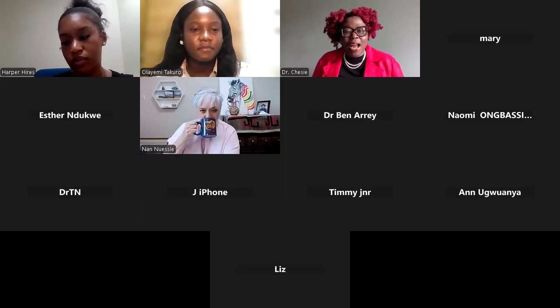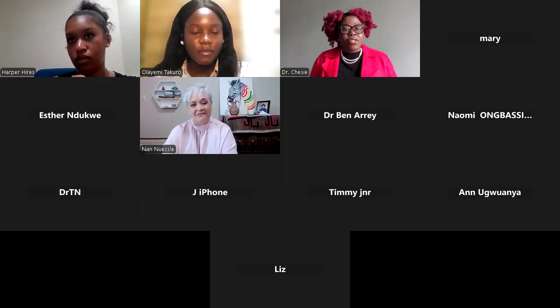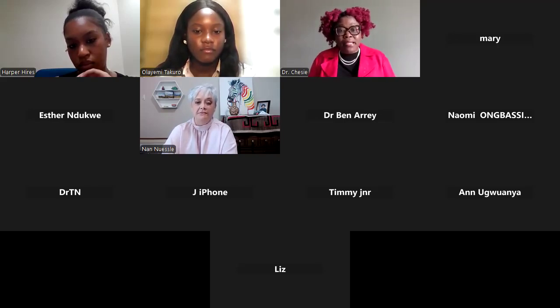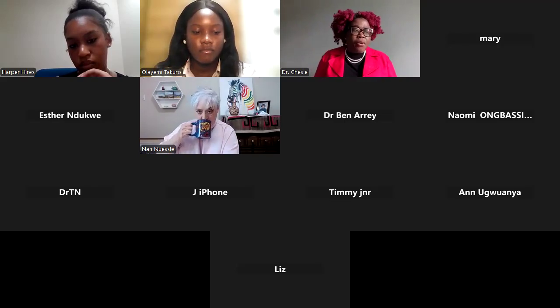Yeah, everything she said are actually the things that happen with some of the errors. And this series of errors that she made mention of in the lab, we call them exogenous errors or in vitro errors, because these are errors that happen after the sample has been collected and before the sample is tested. A lot of things can go in between if it's not stored under the right conditions, transported immediately. There could be things like, due to chemical instability, you could actually have drugs in the sample degrade. You could actually have microbial growth because the sample has not been stored under the right conditions.